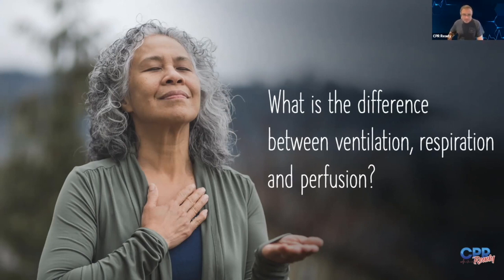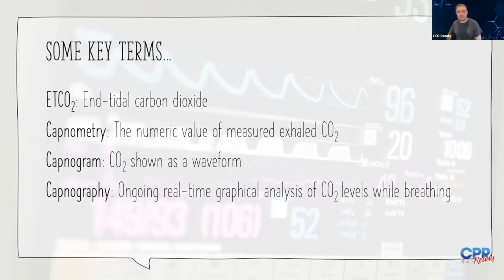Excellent, perfect. So let's talk about a few key terms that I want to make sure we're all on the same page about. So we talk about EtCO2, which is our end-tidal carbon dioxide. So that's the actual concentration of the CO2 that gets measured when a person exhales. Capnometry, that is the numeric value of the measured exhaled CO2.